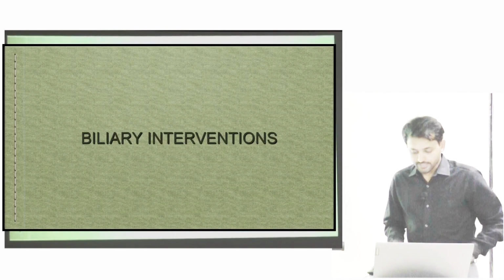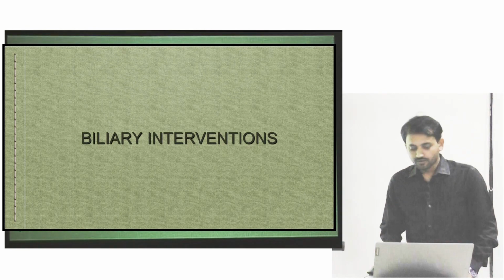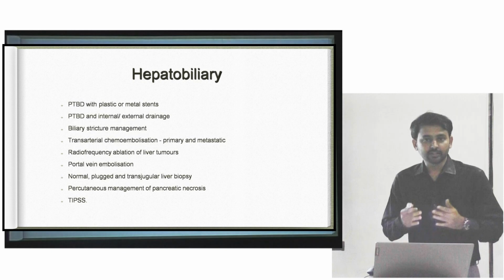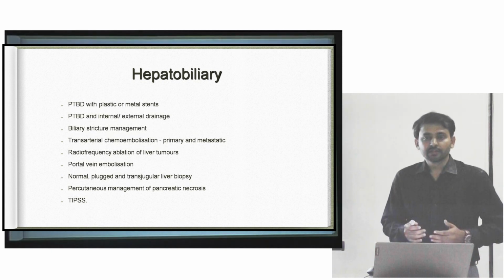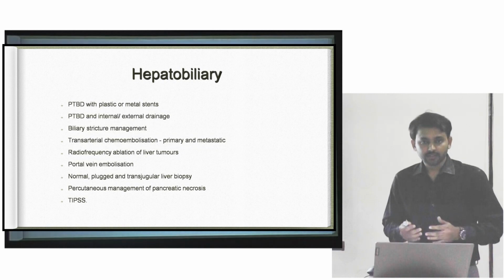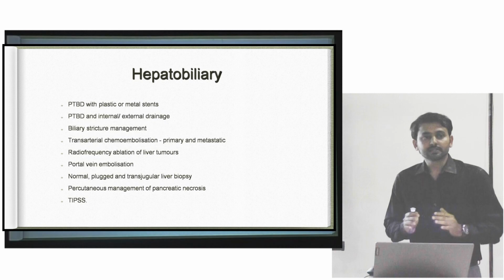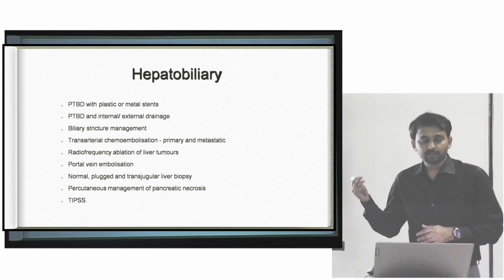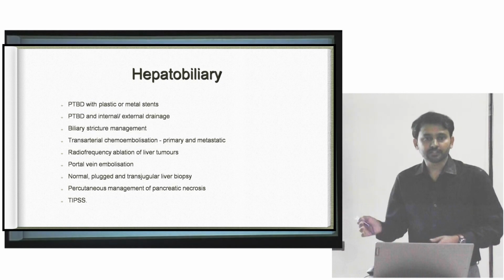So next we come to GI, gastrointestinal. So biliary interventions, mostly PTBDs, percutaneous transhepatic biliary drainage, either combined with internal external drains or metallic stents, self-expandable metallic stents. So PTBD is one of the procedures to relieve biliary obstruction, mostly done in proximal obstruction, that is especially hilar cholangiocarcinomas.